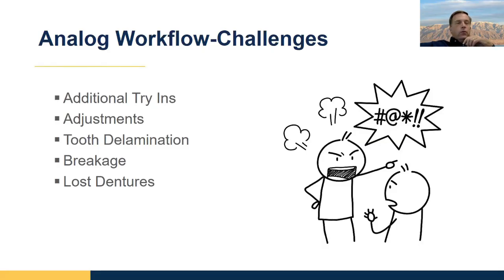So we boil and wash and clean to make sure we get the wax off, and we even scrub the intaglio of the teeth with monomer. But sometimes there's a little bit of wax that can contaminate the surface, and then a very, very small gap between the acrylic and the teeth can form and the tooth can actually pop out, which is not good. It's just part of the denture process, unfortunately.